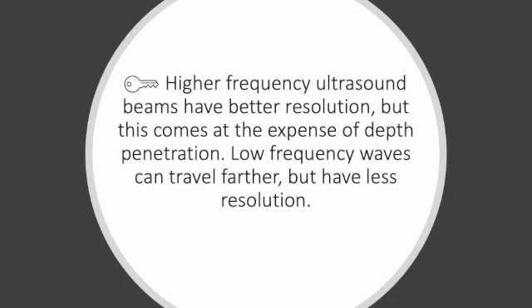Higher frequency ultrasound beams have better resolution, but this does come at the expense of depth penetration. Low frequency waves travel farther, but have less resolution. This is a key point that I want you to remember as we move forward.